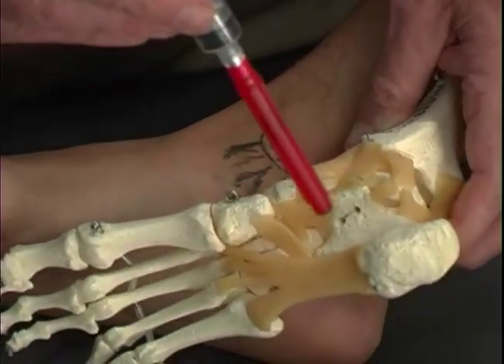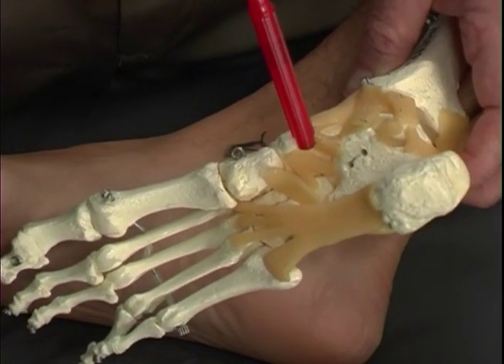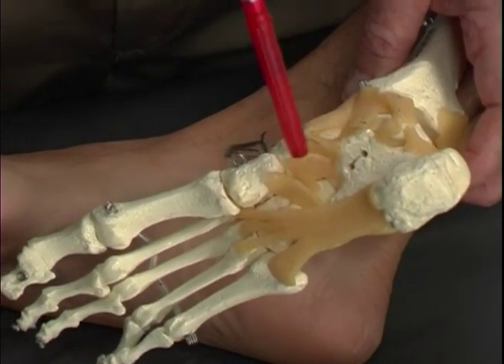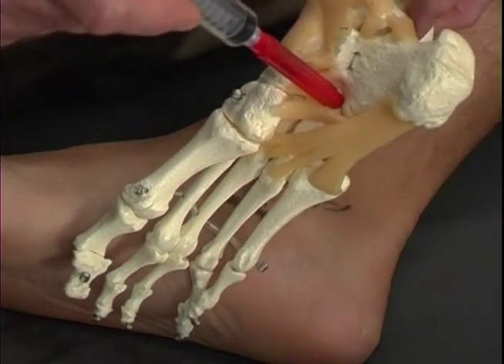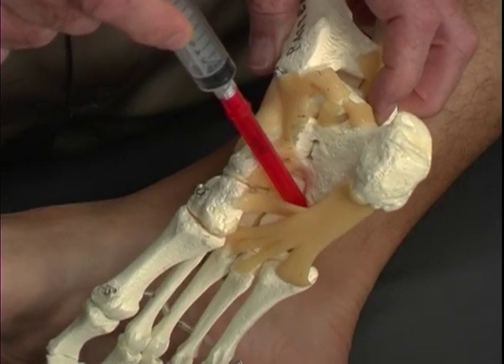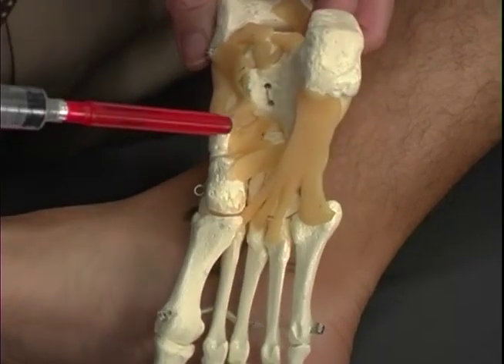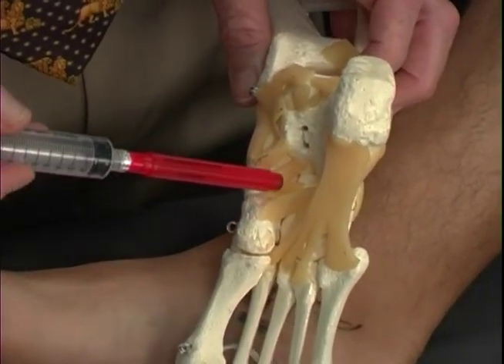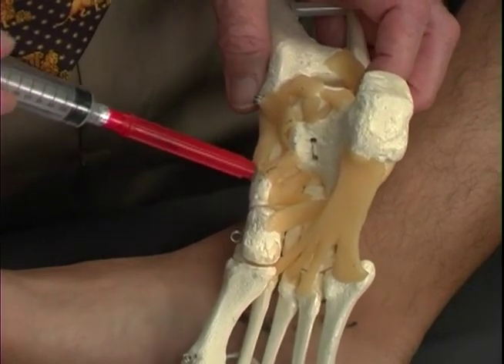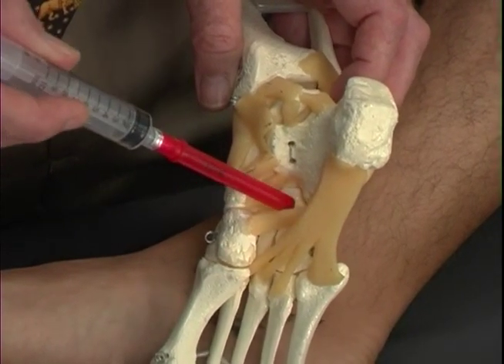We then wish to drop our needle in deep into the ligaments in the bottom of the foot, coming across underneath the arch of the foot to the cuboid bone, which is right across the foot. So we'll be going quite deeply with our needle and hitting the calcaneonavicular ligament and the cubonavicular ligament. We can see those underneath the foot right here and here that come across, and as part of the interior part, here's the outer part of the spring ligament, and these are the interior parts of the spring ligament deep in the foot.